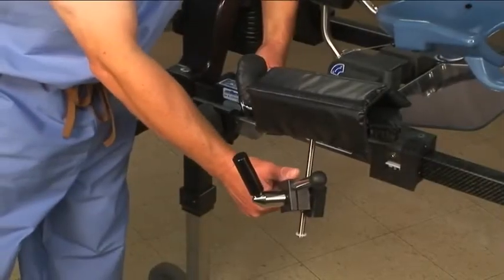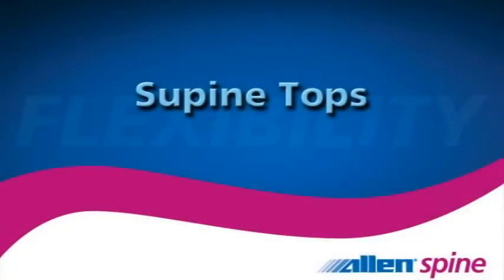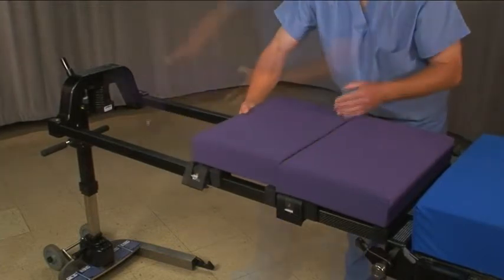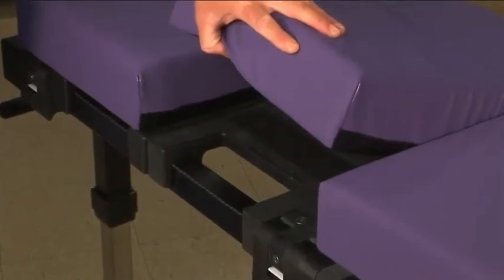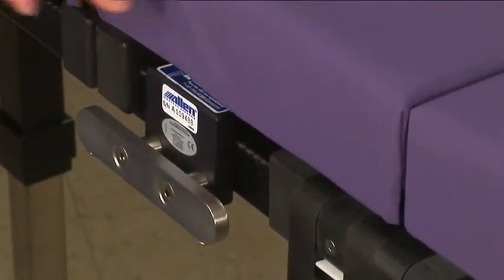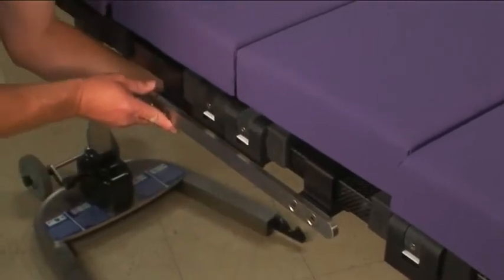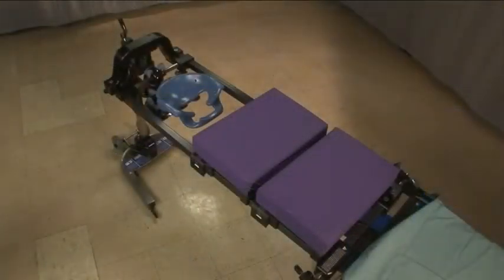The prone arm board, rail clamp, and arm board rail can be stored as a single unit to simplify setup and storage. The supine tops turn the frame into a solid surface that can be used for supine procedures. A variable number of supine tops can be used depending on the particular application — four supine tops will cover the entire length of the frame. There are cutouts in each supine top where other equipment can be attached. The arm board rail, short accessory rail, and long accessory rail spanning two cutouts are all available for use. Using two supine tops and a C-flex enables you to use a Wilson frame with the FlexFrame.